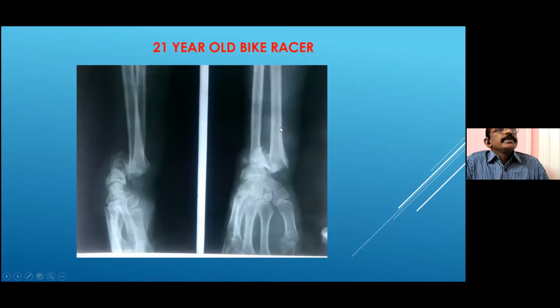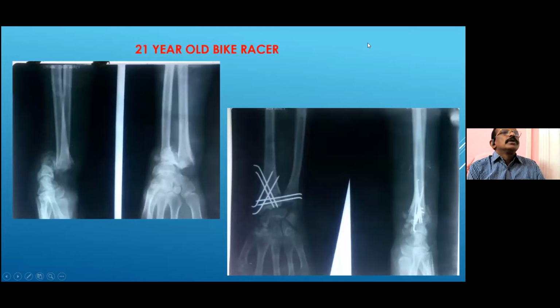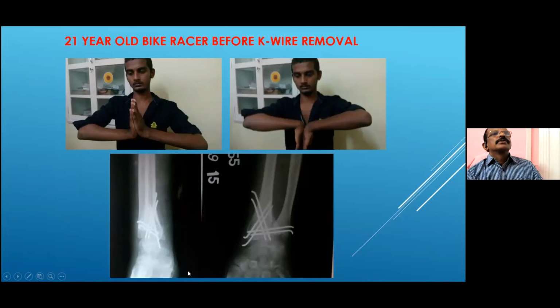This is another case, a 21-year-old bike racer with a bag of bones. He also came to me from Tamil Nadu. This is his pre-operative X-ray and also the post-operative X-ray. You can see the reduction and also the fixation. This is before wire removal, the same person. You can see this range of motion.